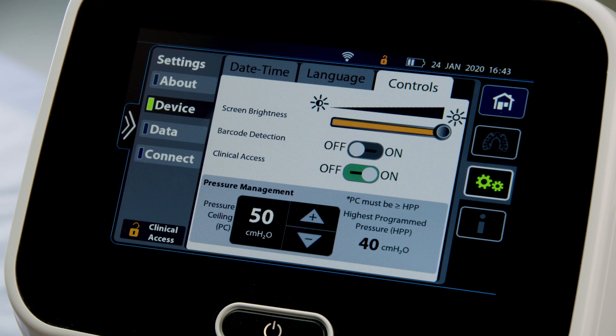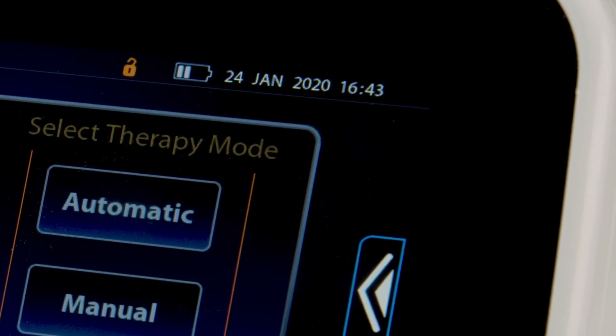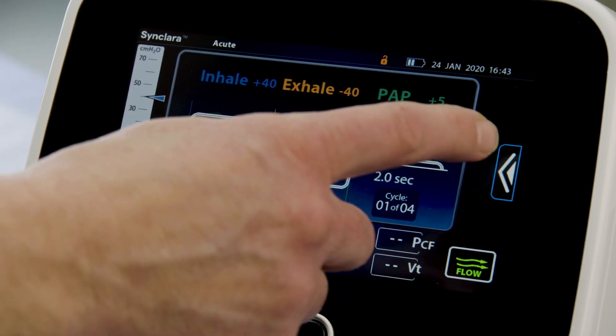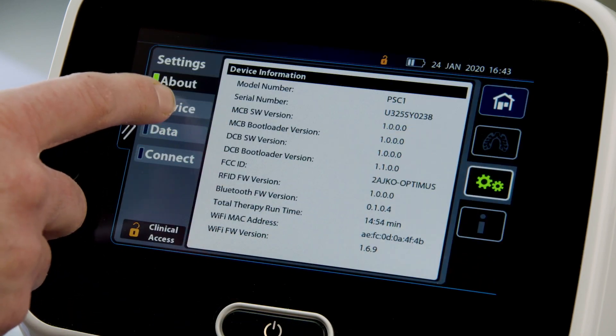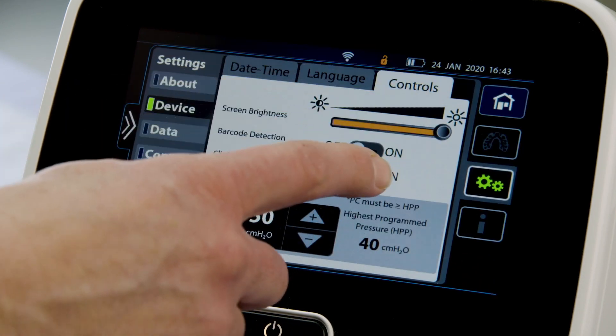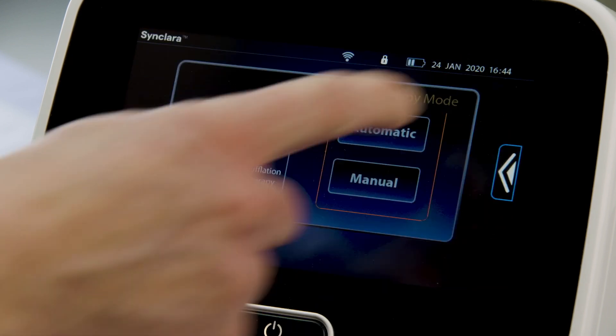If applicable, contact your facility administrator to get the key code. When complete, press the Home menu control to exit. To prevent unauthorized persons from adjusting the settings, disable clinical access after you have made the settings by pressing Control, then slide Clinical Access to OFF, and press the Home menu control to exit.